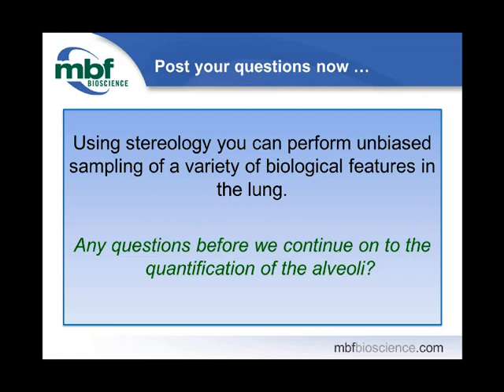Okay, one question I'm getting is how many minimum lung sections per lung are required for the stereological evaluations? Now that is something that we're not going to be able to answer directly with a number, but what we're going to be able to do is work with you and look at your system. You're going to be an expert in your system, and what we really need to figure out is what type of precision you need.